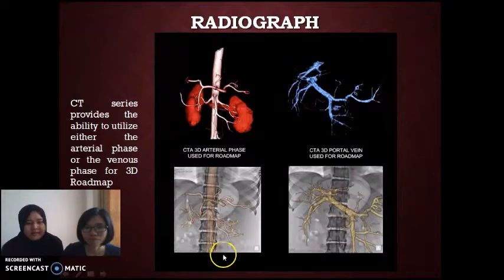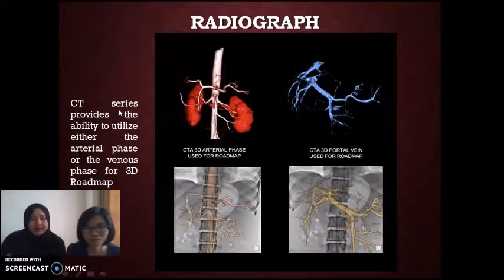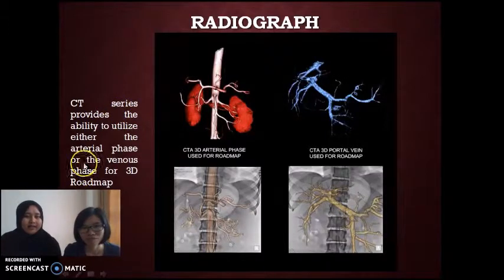Yes, beautiful, right? Then it also applies the same technique for the venous phase. This is the venous phase from CT scan combined with the angiography image, and this is the arterial phase. The CT series provides the ability to utilize either the arterial phase or the venous phase.